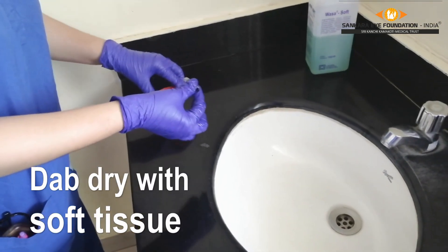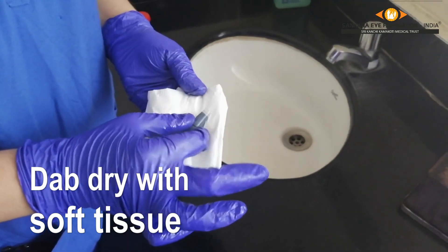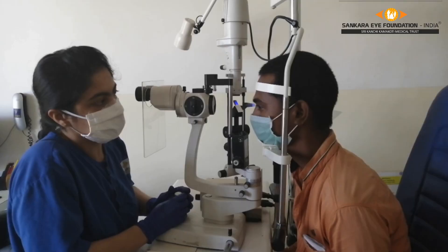After 3 minutes, take out the instrument from the solution, then clean with a dry tissue, after which it is good to use again.